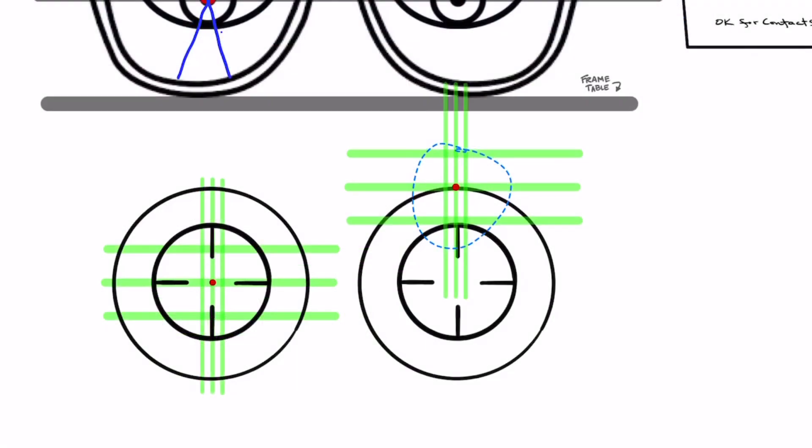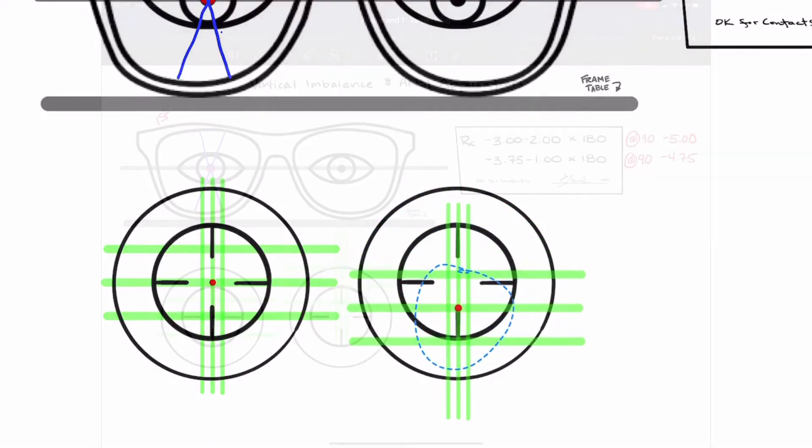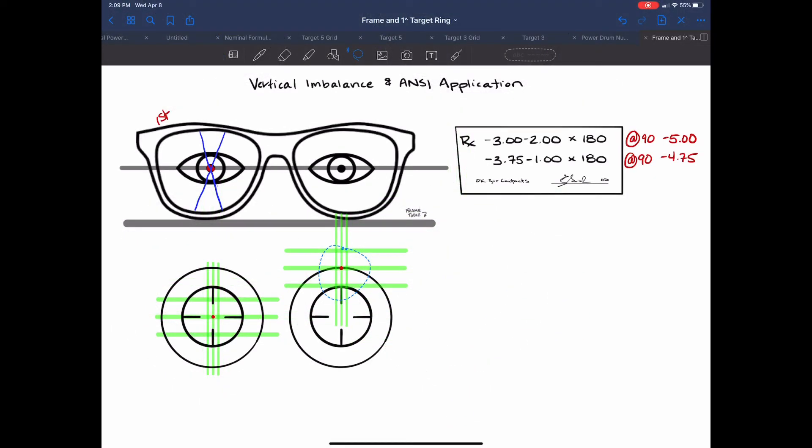This could be where it's at right now at one diopter base up it could be a half of a diopter it could be a third it could be a quarter it could be down. So wherever it is without moving the frame table you're going to center it and then you're going to read the amount of prism.